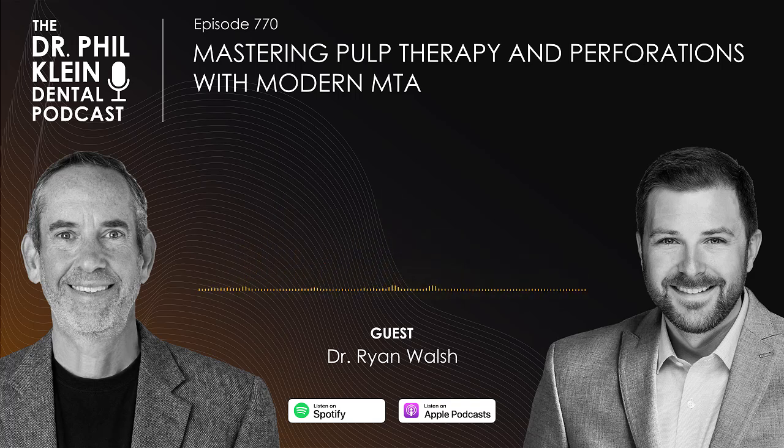But before I turn the mic over to you, I think it's important to mention to the GPs out there that MTA isn't just an endodontist material. It's very much a general dentist material as well, especially now as more of us focus on minimally invasive dentistry and are doing everything we can, obviously, to preserve the natural tooth. So I think we can agree that MTA has become a proven and reliable solution for really deep cavities and vital exposures.